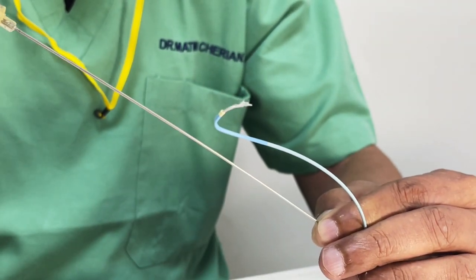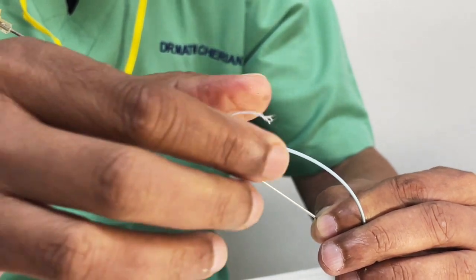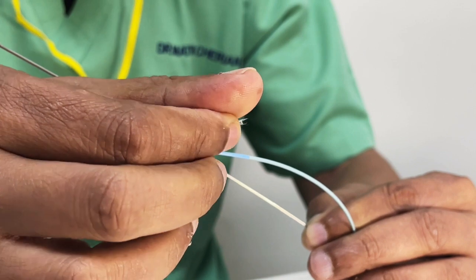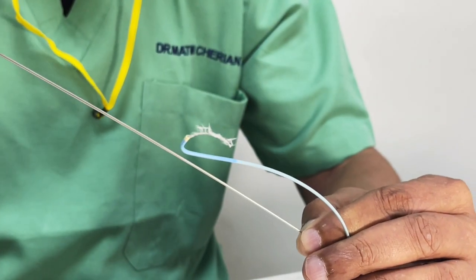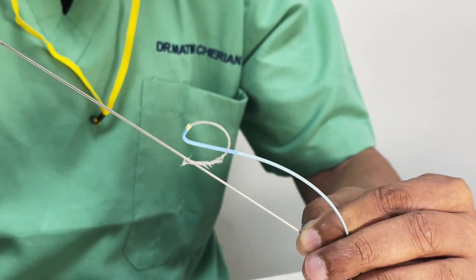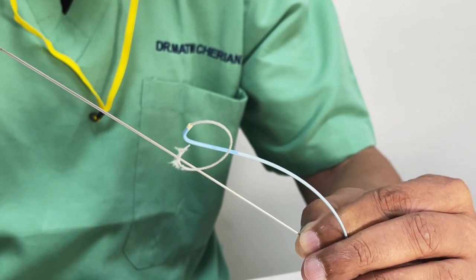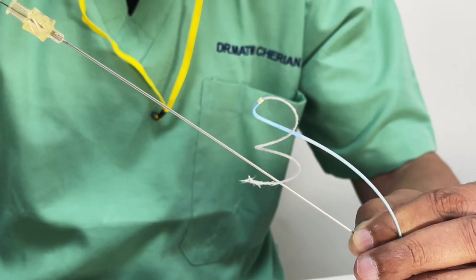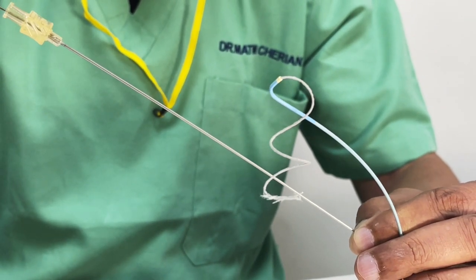like occupying space. See, this is just because it is wet, but you can see the whole thing is fibered. Can you see? And since it is a 16 mm coil, the coil loops are very large. But if it is a smaller coil, the coil loops will be very, very small. Can you get this? Here it is as it forms. So you have this coil coming out.